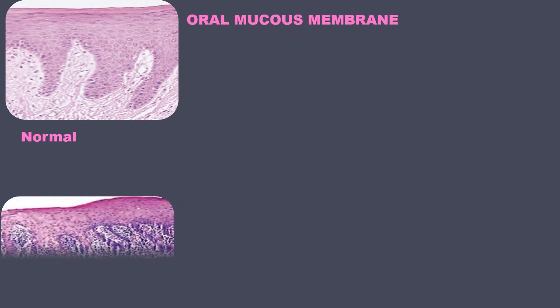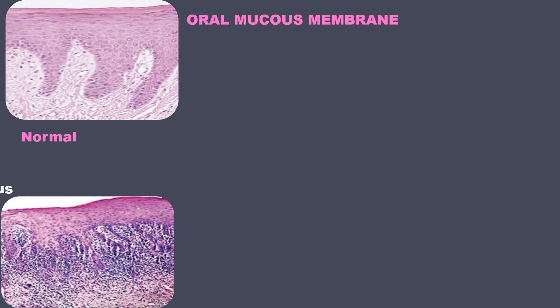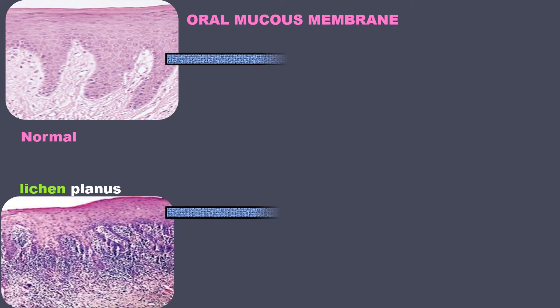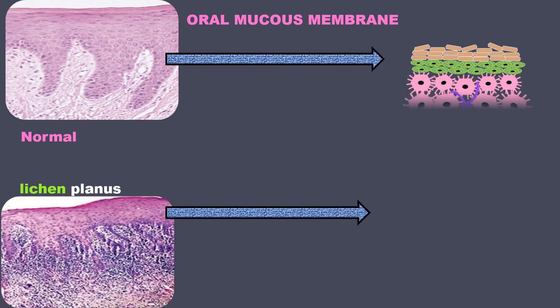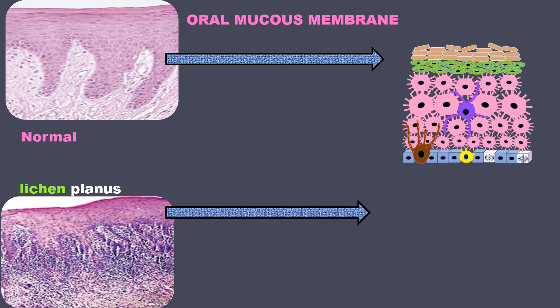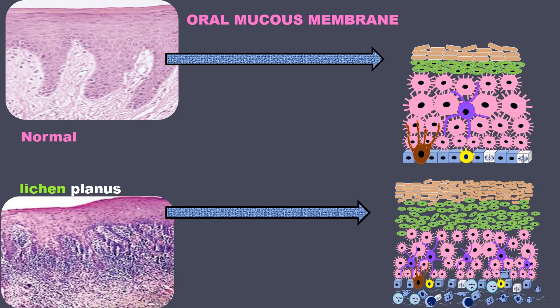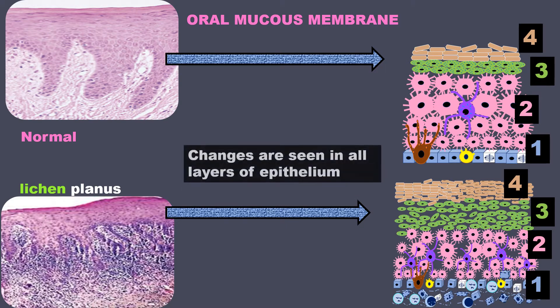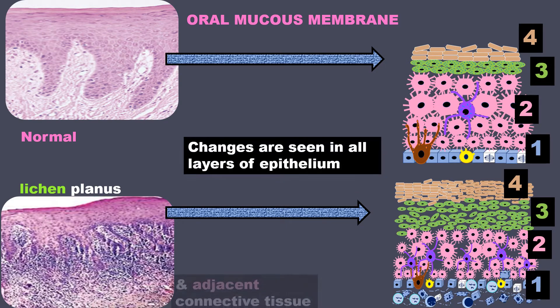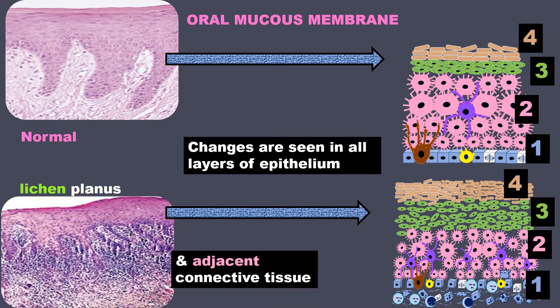Under the microscope, this is how a normal oral mucous membrane looks like, and below its appearance in lichen planus. You can see that there are changes in both the images. When you take a closer look at the epithelial cells, you can find changes in all the layers of epithelium and also changes in the connective tissue.